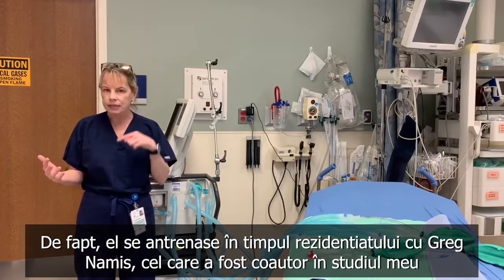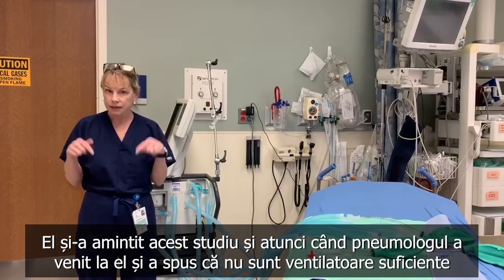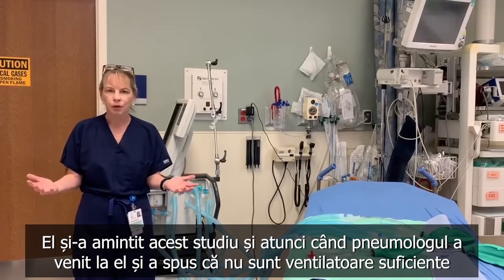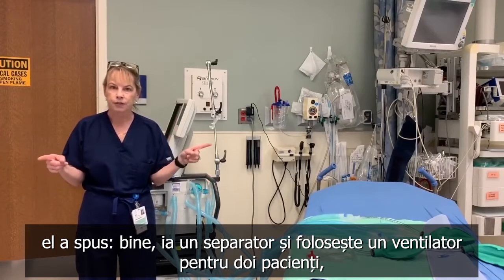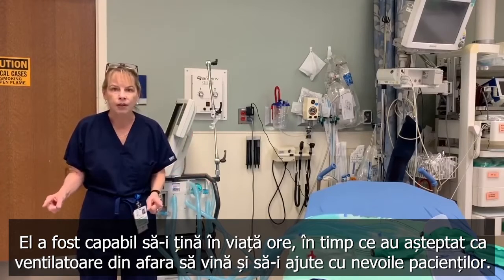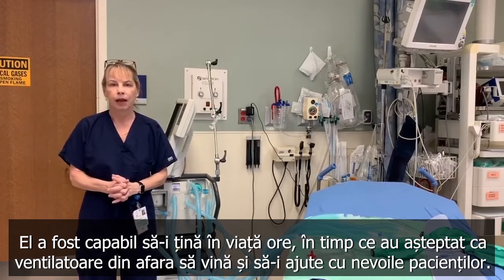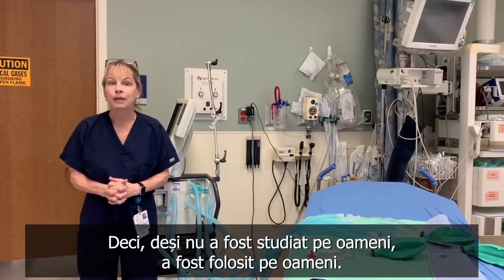He actually trained in residency with Greg Namus, who was my co-author on this study, in residency at this institution, and he remembered this study. So when the respiratory therapist came up to him and said, "We don't have enough ventilators," he said, "Okay, get a splitter, use 1 ventilator for 2 patients." And it was very successful. He was able to keep them alive for hours as they waited for outside ventilator support to come in and help them supply the patient need. So although it hasn't been studied in humans, it has been done in humans.